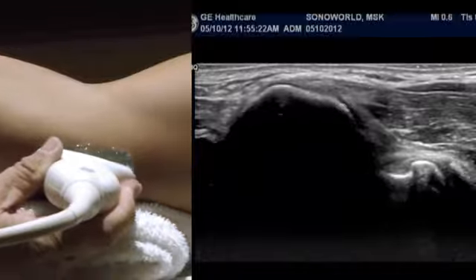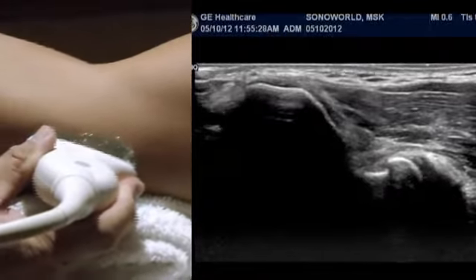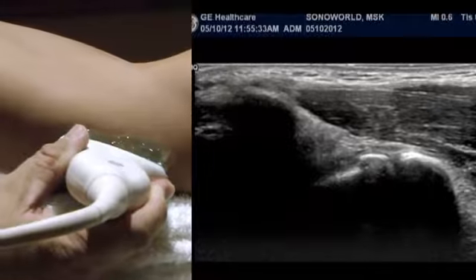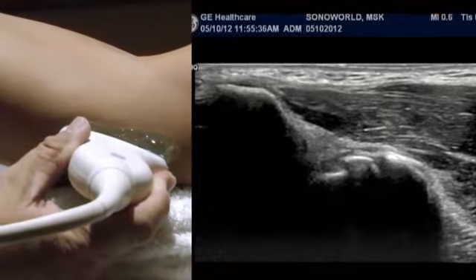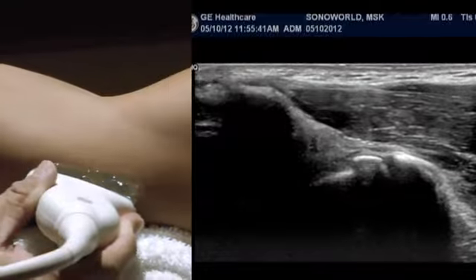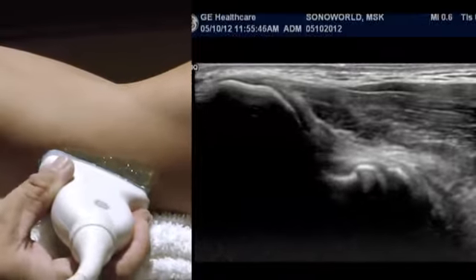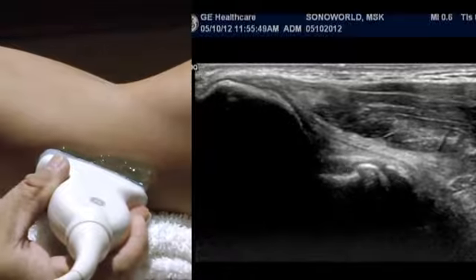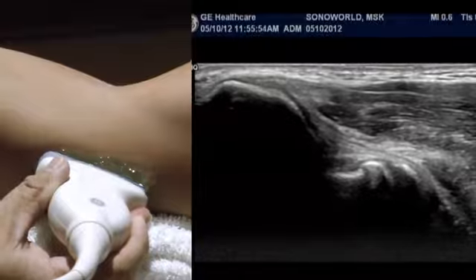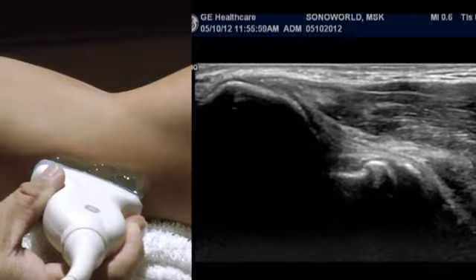Here you see at the top of the image the apex of the epitrochlea down to the ulnar notch into the trochlear area of the humerus. Then you see the joint space and then the shark fin shape of the coronoid process, where you now have the nipple-like sublime tubercle. As you connect the two bony structures of the epitrochlea and that of the coronoid process, now you see a packed fibrillar pattern representing the anterior bundle of the ulnar collateral ligament.